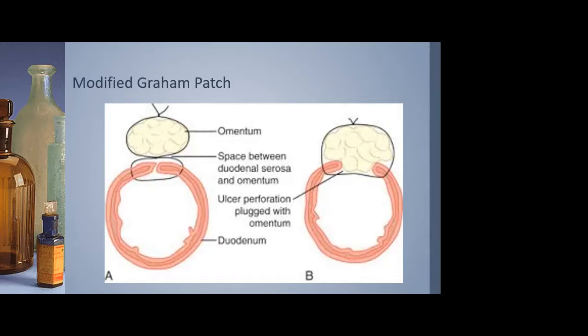As far as the management, I think laparoscopically, the management of the tails, which does become an issue if you have long tails, is 100% dependent on the surgeon that's doing the case. So in terms of managing the tail, you'll go through the omentum first, and you'll go through twice. What that does is bind that suture up wherever you need it. And so that keeps your tail as long as you need it. And then as you drag that up, and your assistant can help you, that suture won't move because you've gone through the omentum twice. And then you do whatever management you need to do with the ulcer, and you go back to where that was through the omentum and tie that down. So those are just kind of management issues, minimally invasively, that you can do to help minimize the struggle in the OR.